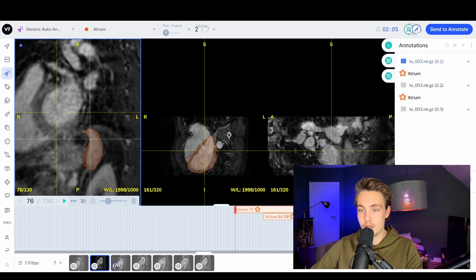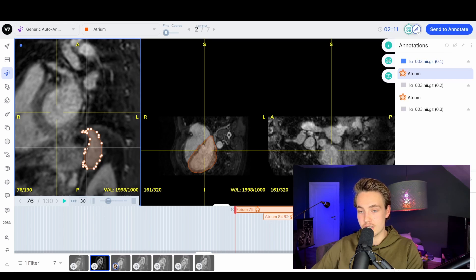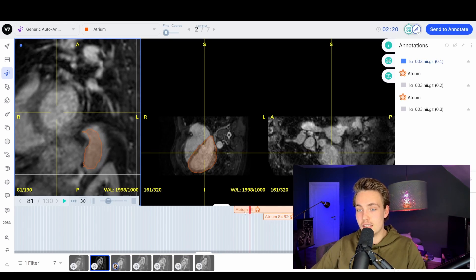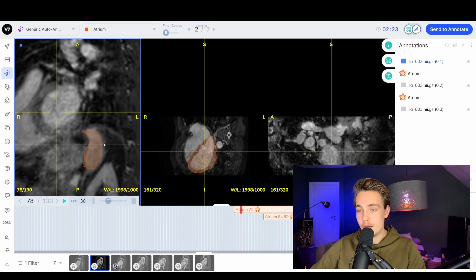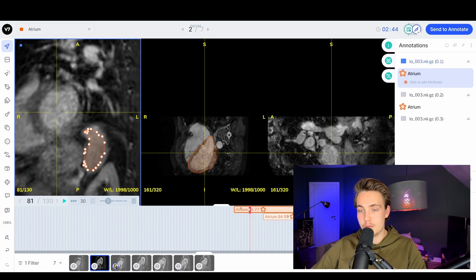We can even zoom in - this is actually pretty good. We can go in and also change it, so we can just extend it a bit. If you tap on the annotation down here at the timeline, we can just correct it a bit. We can see we get some errors up at the top; we can just drag those in. Then we can see how it develops over time. We go to the next frame and correct for that. Using the edit tool, we can press in and basically extend the segmentation mask for our segmentation, correcting for the auto annotation tool as it keeps evolving over time.